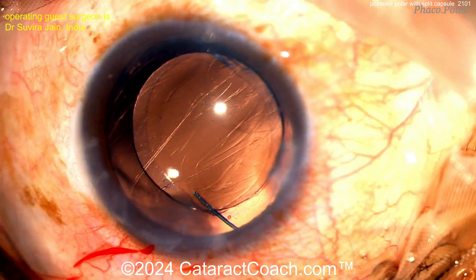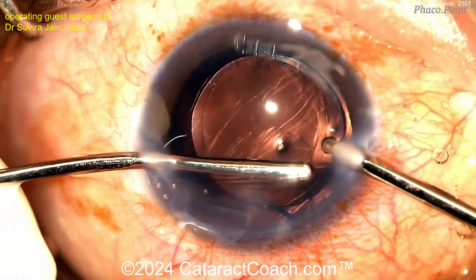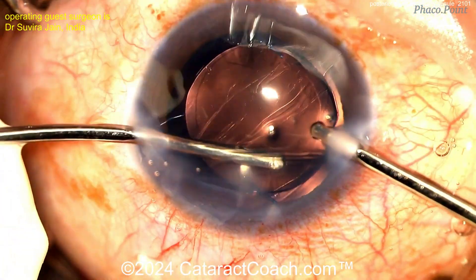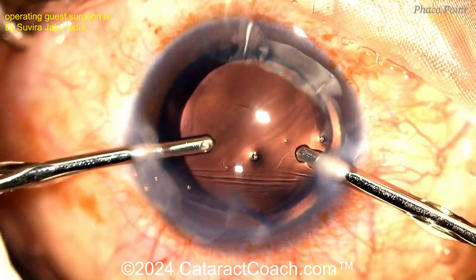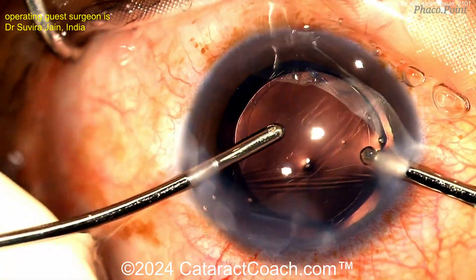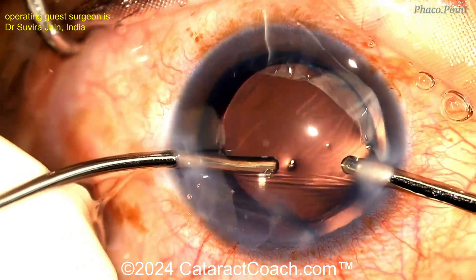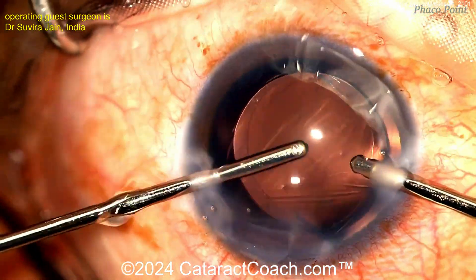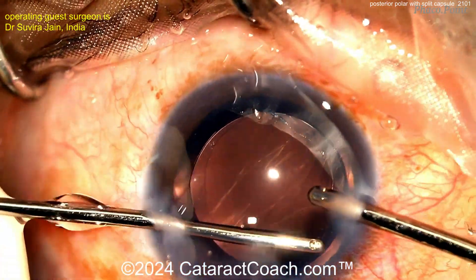That's a really nice case — tough case. There can be cases like this with posterior polar. The posterior polar opacity means by definition that the posterior capsule at that point is weak, fragile, or sometimes, like in this case, frankly absent. The patients can have — although it's rare, like this case — a pre-existing split posterior capsule which you're going to have to deal with at the time of cataract surgery. Beautifully done here.